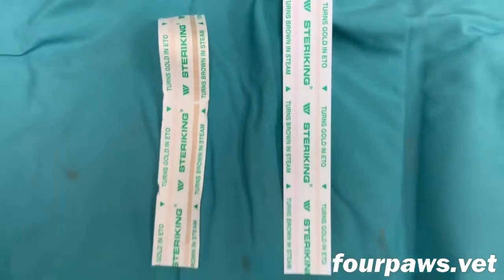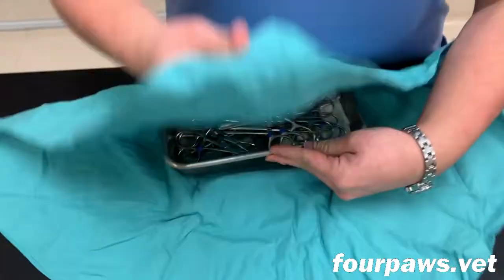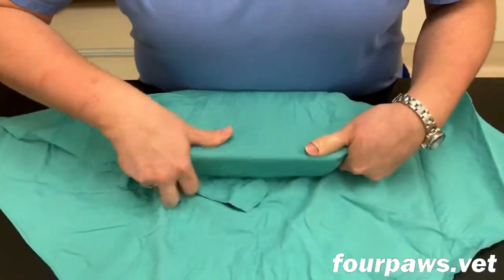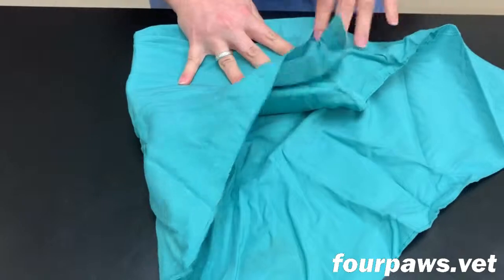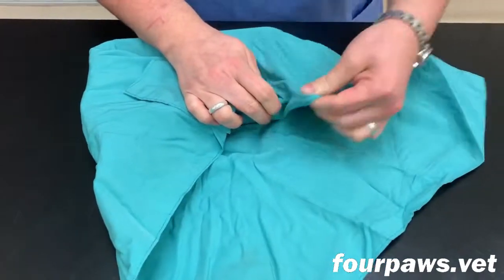Once the tray has been filled with the correct instruments, an indicator strip, and the correct number of gauze sponges, it then needs to be wrapped in these cloth drapes. Most surgical packs are double wrapped and there's a very specific technique that needs to be used in order to wrap them properly.